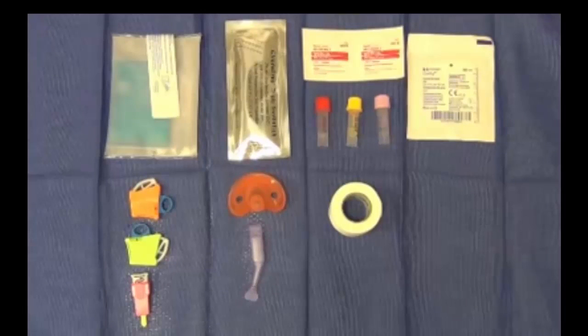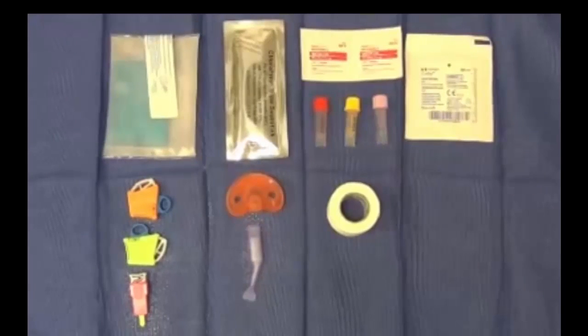An automated heel lancet. The type of lancet is selected based upon the size of the infant and the subcutaneous tissue that must be penetrated. The micropreemie tenderfoot lancet is used for those infants less than 1,000 grams. The preemie tenderfoot lancet is used for those infants greater than 1,000 grams. The newborn tenderfoot lancet is typically used for those infants that are term through the first 6 months of life. Each lancet varies in the length and depth of the incision created.